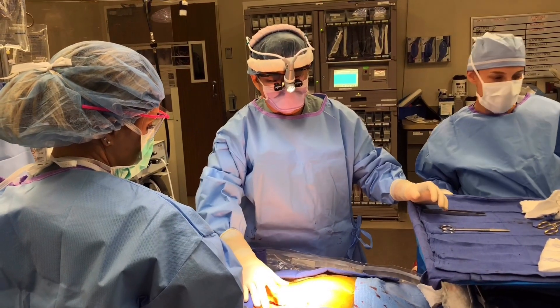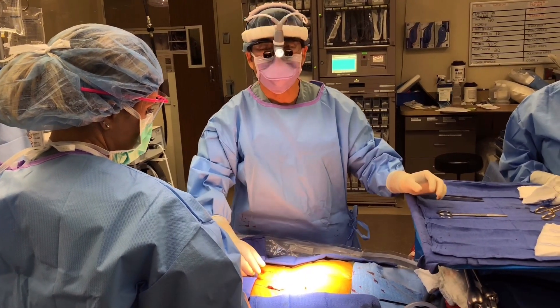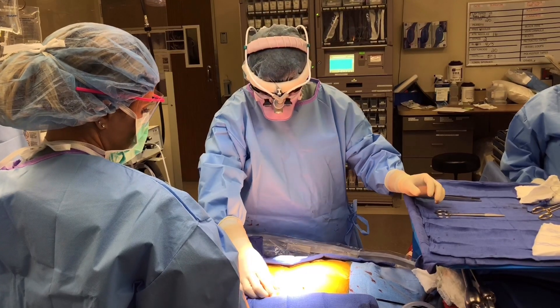Alright, we're almost done. I'm about to close the wound. All the screws are in. It went perfectly. We're all wishing you a speedy recovery and best wishes. All the screws are in perfectly nice.